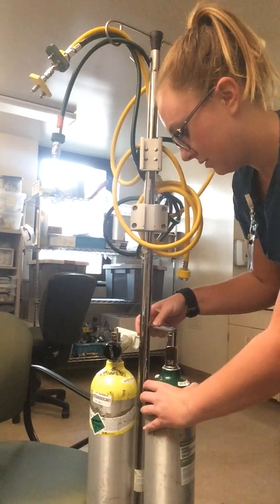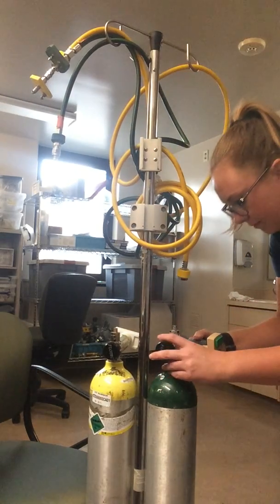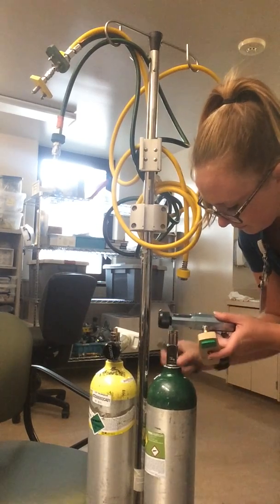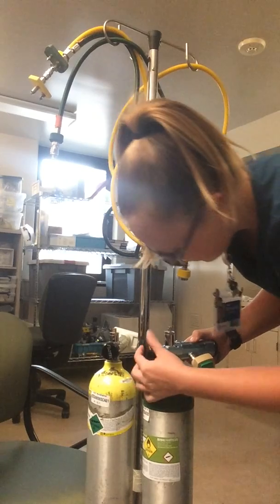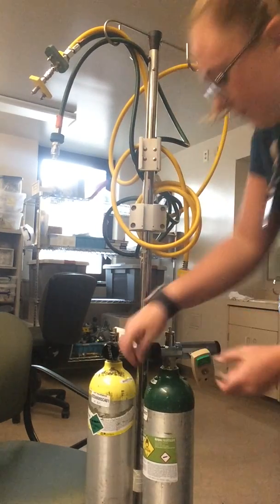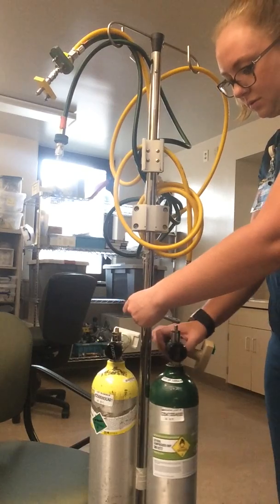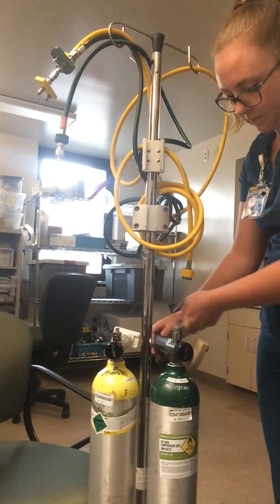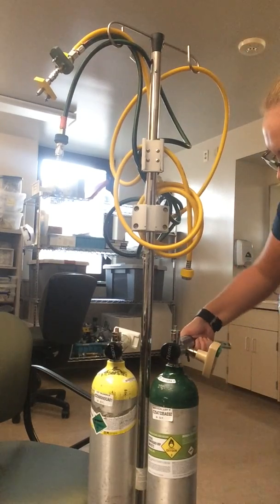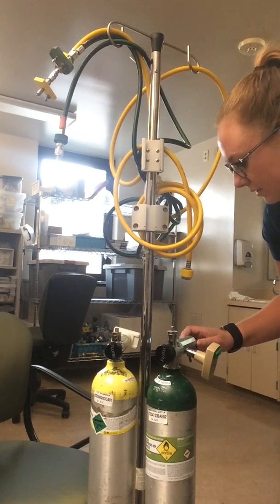First off, I'm going to crack the tank. It's an empty tank so it won't make any sound. Make sure that's nice and tight. I'm going to take a careful turn. I have about five liters per minute going right now. It's obviously empty, so turn that off.